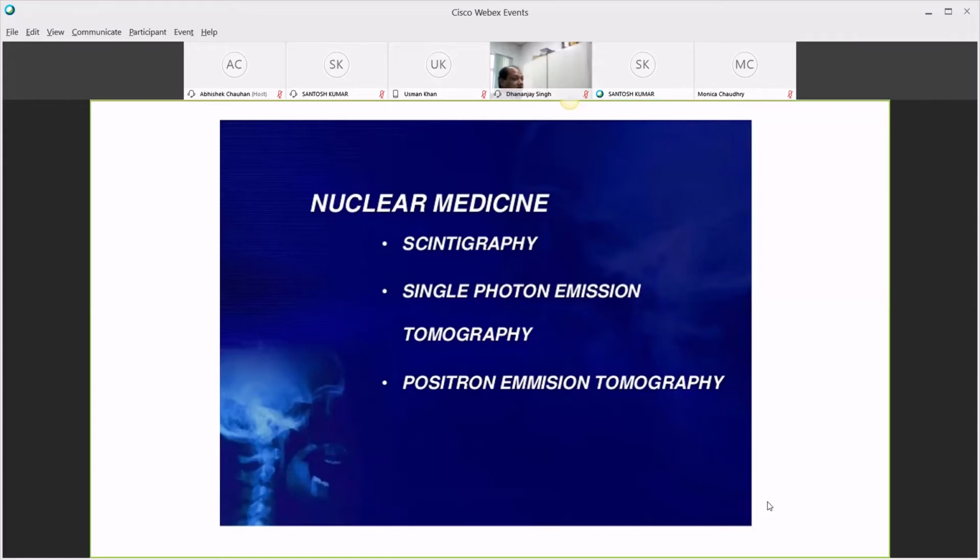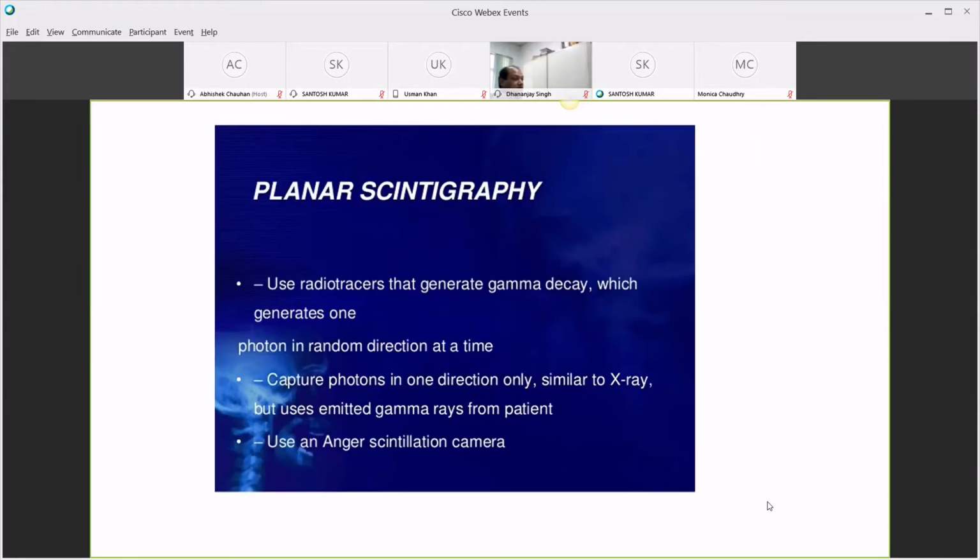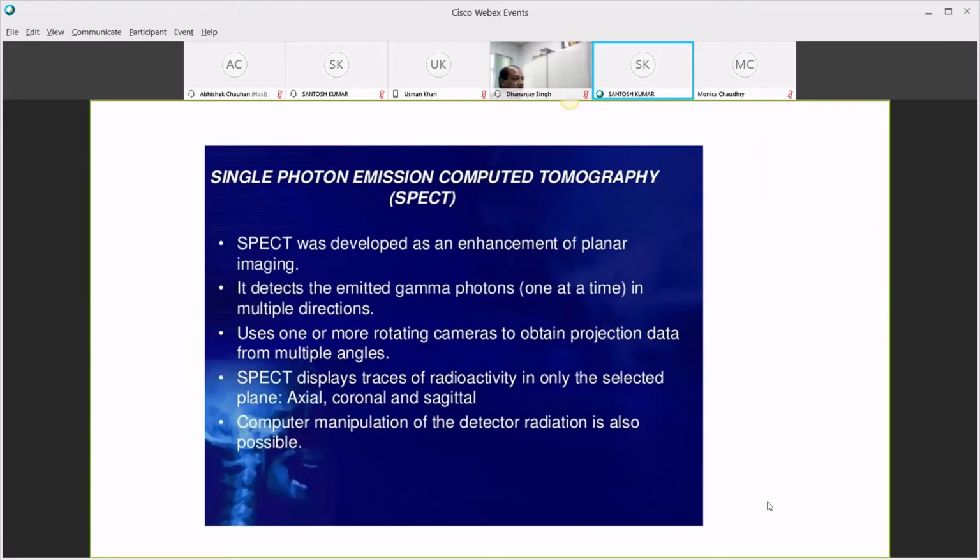but I just let you know there are differences between the planar imaging and the SPECT. So this is normally the camera look-alike for the SPECT CT scanner, on which you can do the CT also, and the SPECT, that is the nuclear medicine imaging.